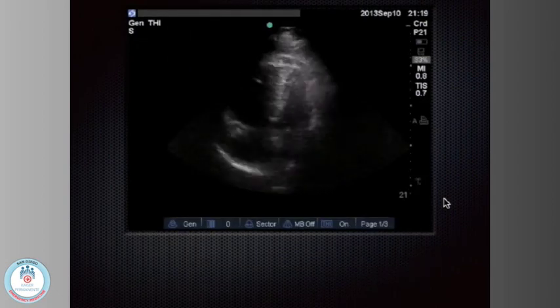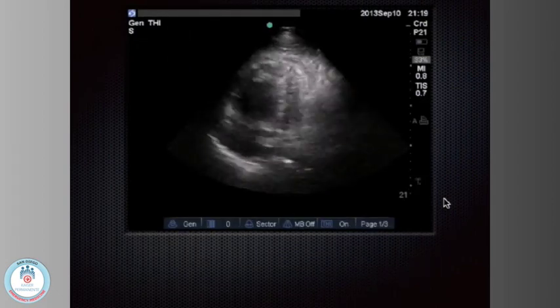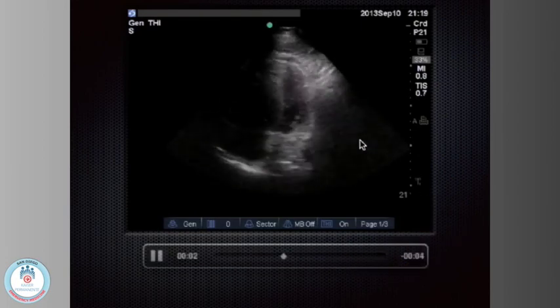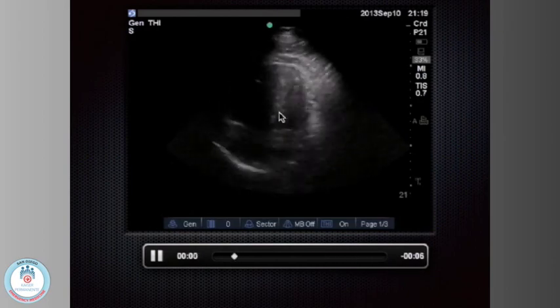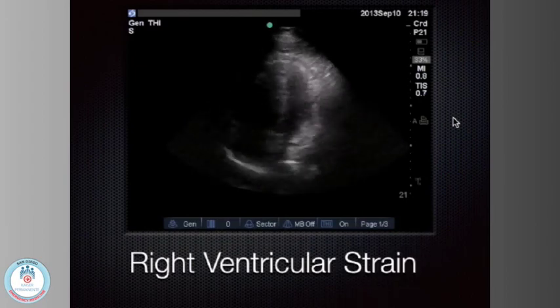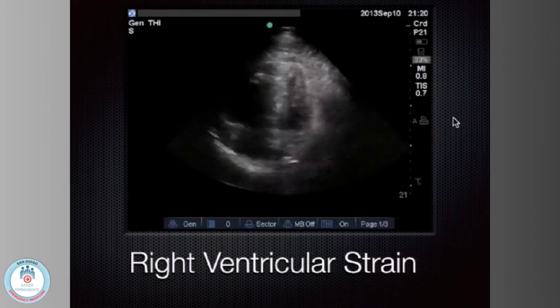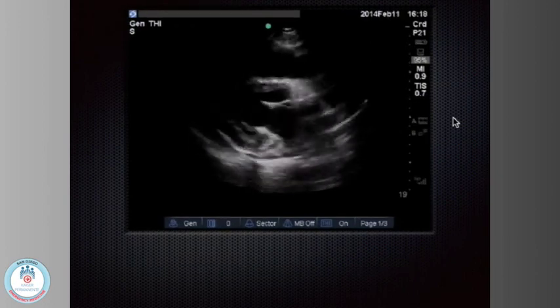More MR, I think we're coming to an end here. Oh, what's this diagnosis? PE. Do you guys see that? So this is the RV over here. It's huge. There's a little moderator band kind of poking in right there. That's how I know that's definitely the RV. LV is empty, obstructive process in the heart. Massive PE, RV strain. You ever give thrombolytics to PE before? Anybody? Yeah. It's kind of scary. Several times here. Is that right? Yeah, it's one of those kind of scary maneuvers.